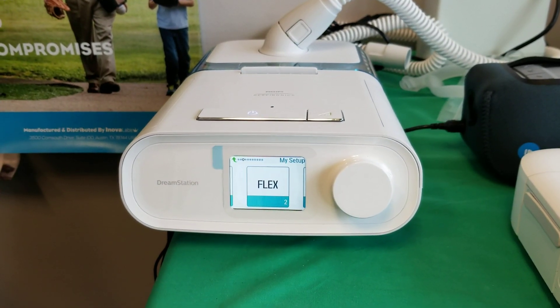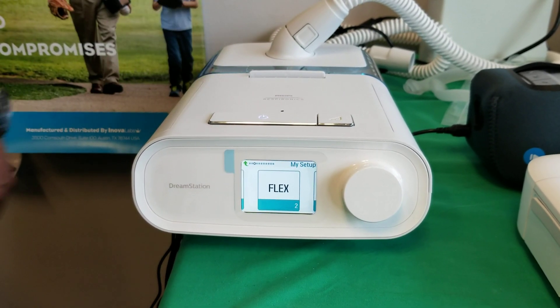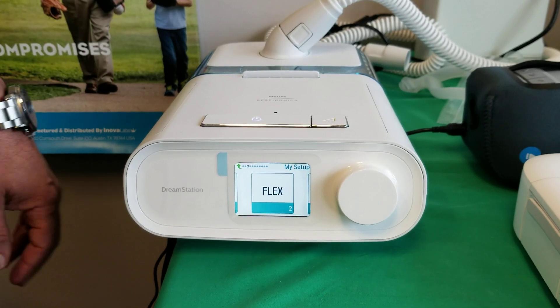This basically makes the pressure in the DreamStation drop slightly during exhalation. And when you feel it, you have to make sure you can breathe against it. If it's not comfortable, you can just move the settings around to where the comfort is there.